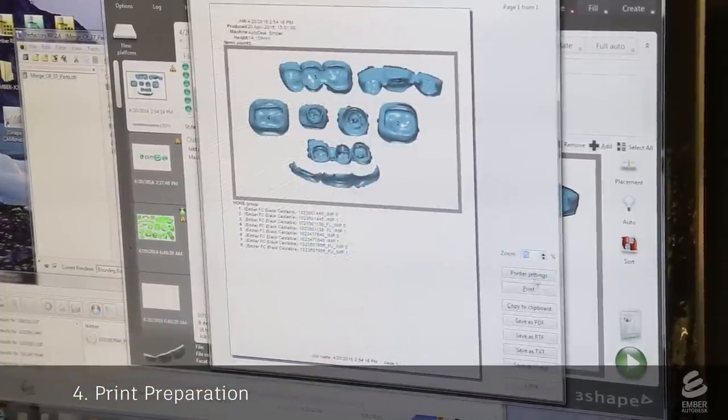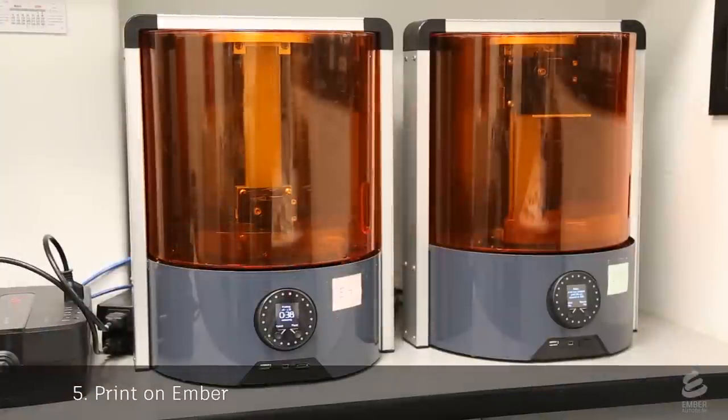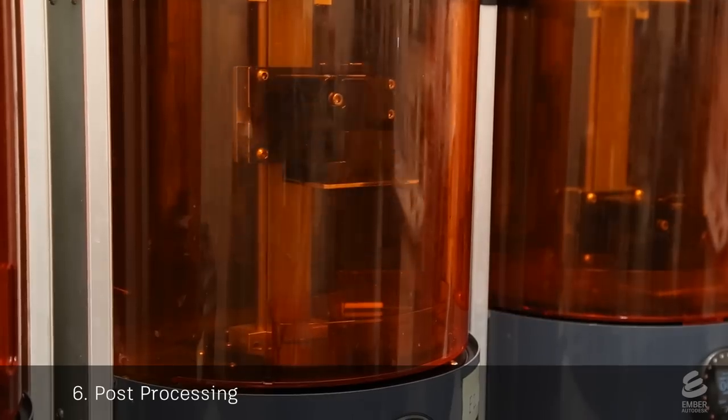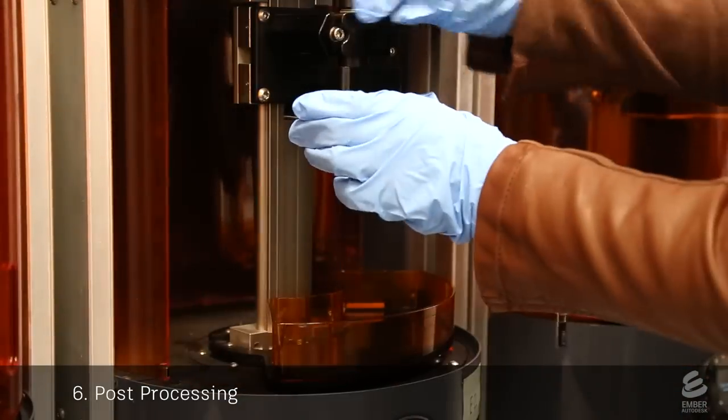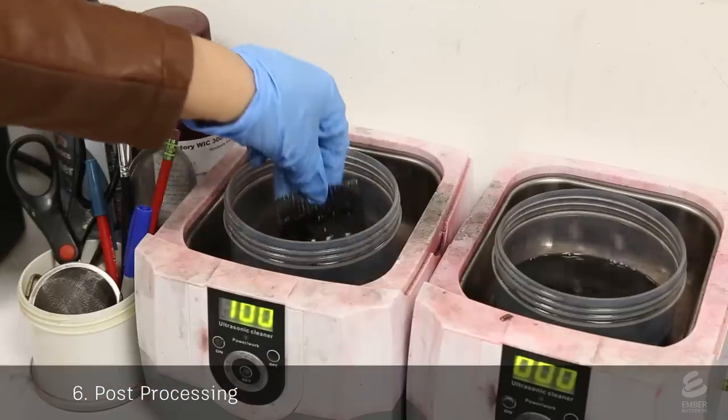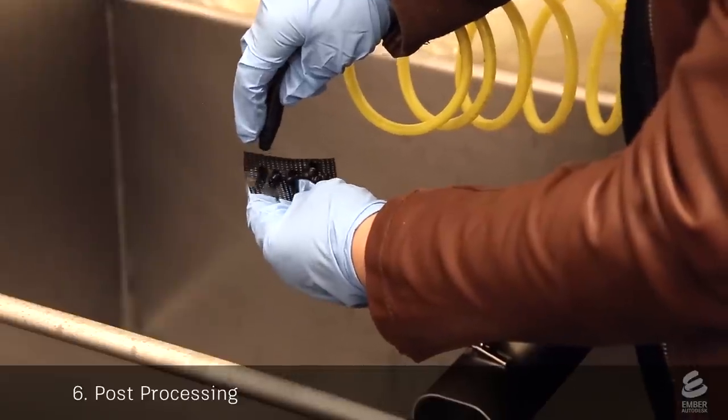Now this collection of crowns is sent to an Ember printer. A tech starts the printer. The print time is typically around 40 minutes. Glidewell uses a specially formulated resin, which will completely burn out later in the process. After the print is done, a tech removes the build head from the printer, scrapes off the print, washes it in alcohol, and dries it with an air gun.